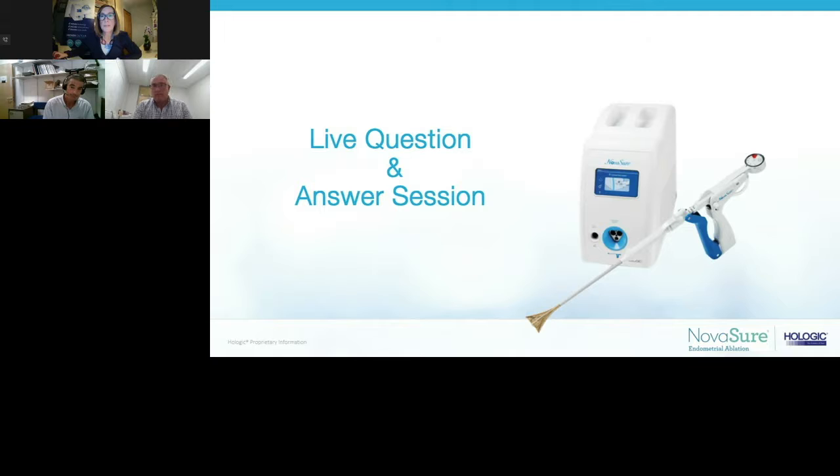Great. And Mr. Underwood, what's your experience? We offer a Pipelle to everyone, just as a routine. If they don't want it doing at the time, then we will do it just prior to the ablation. That's just our local policy. Up until the NICE guidance came out, everyone had an ultrasound scan as well. With the new NICE guidance, we do see and treat HMB clinics.